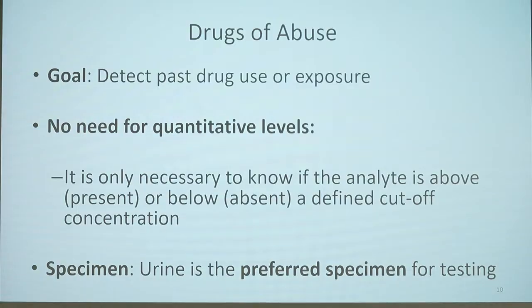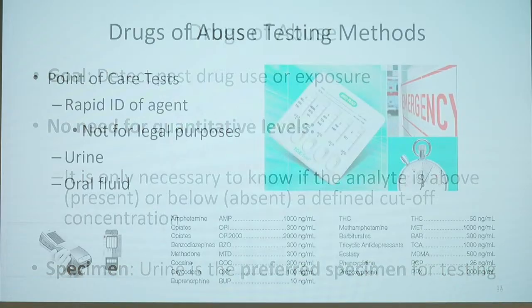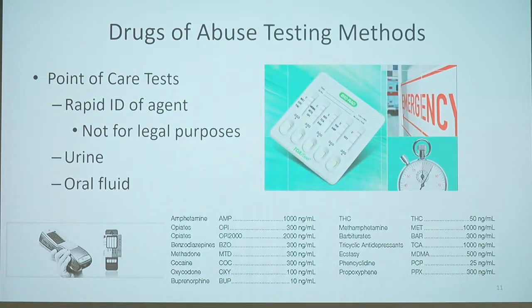If it's below, then no. Here are the analytes that are detected in a standard urinary drug screen with their cutoff levels. So you have amphetamine, cocaine, PCP, ecstasy.